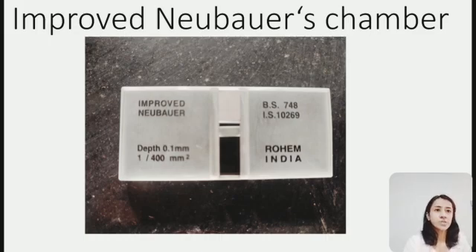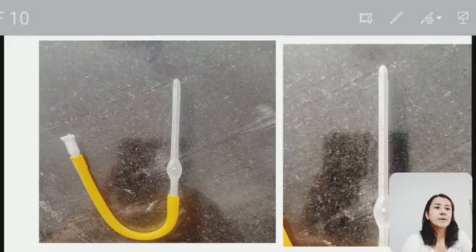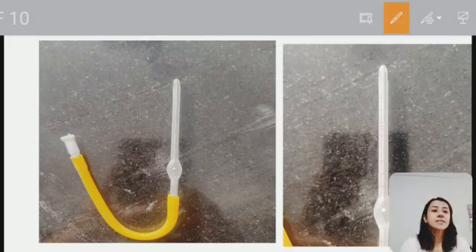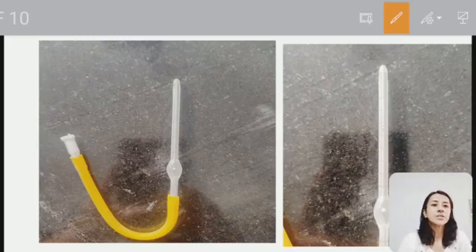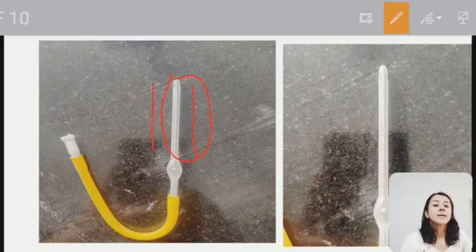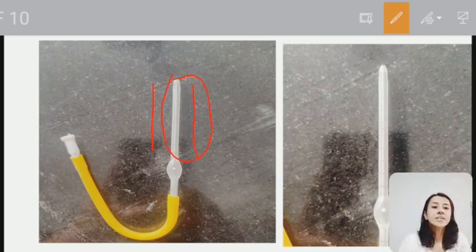Next is the WBC pipette. You can see here this is a WBC pipette. It consists of a capillary tube, this part here, and a stem which is widened into a bulb.